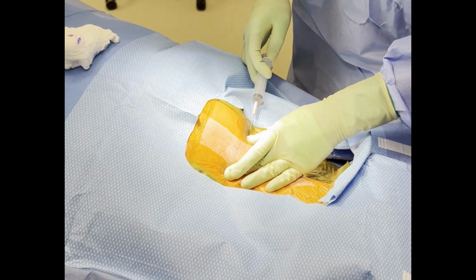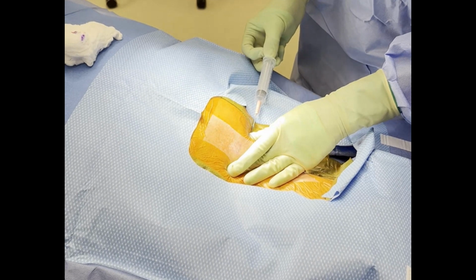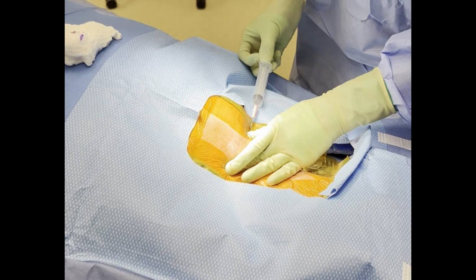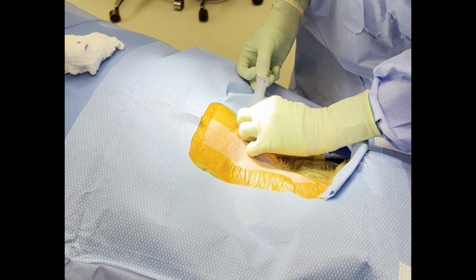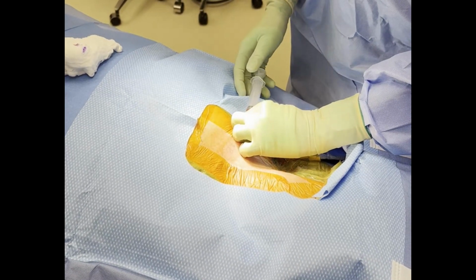To create your venous access, advance a needle along, then underneath the clavicle along the track of injection of local anesthetic. This can also be done under ultrasound guidance. Other ways to confirm placement without ultrasound guidance would be looking at the color of the blood and looking to see if the bleeding is pulsatile or continuous and oozy.